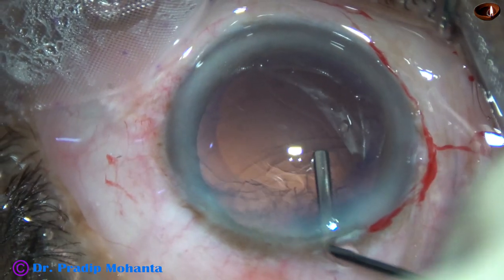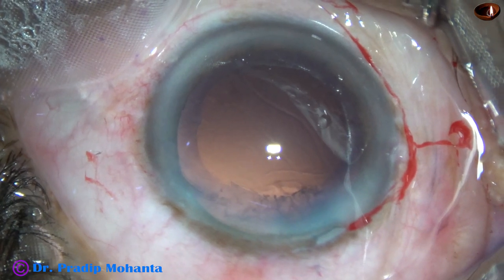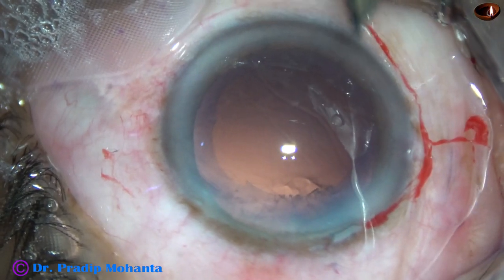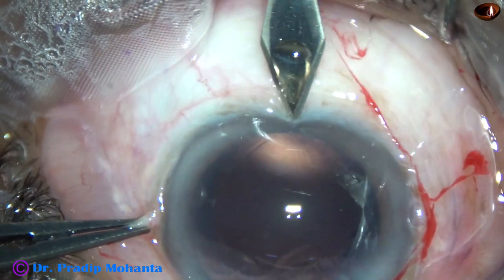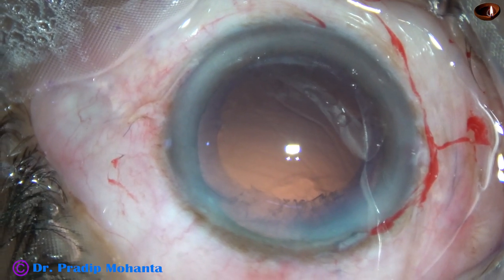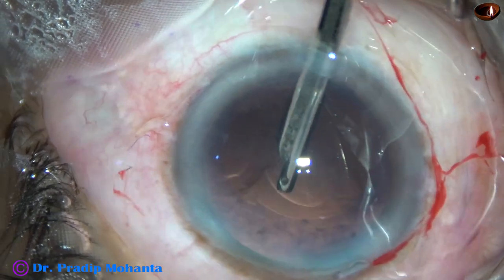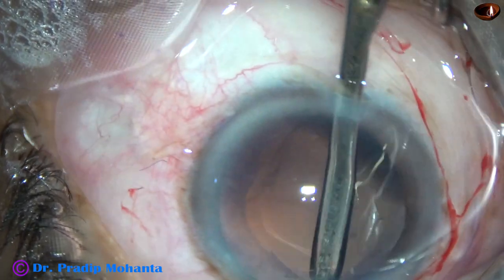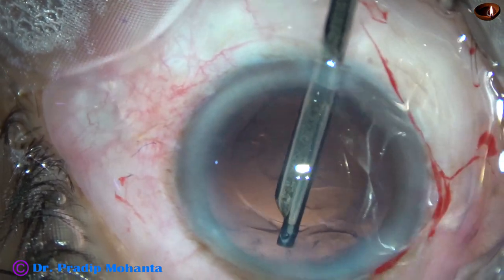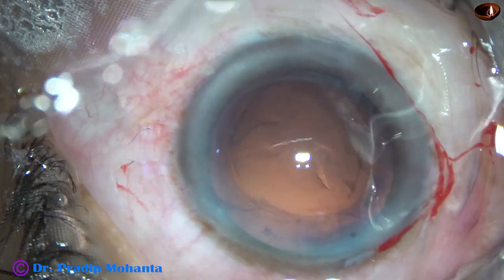We have to spend some more quality time for this patient. Very little cortex inferiorly, but superiorly from 11 o'clock to 1 o'clock there is a lot of cortex. For this, I am going to make another side port at 6:30 o'clock. Through this side port goes the 23-gauge Simcoe. Simcoe is very friendly when you have zonular weakness because you can use very low to adequate vacuum — control is much more with this instrument. And the cortex is nicely cleaned.